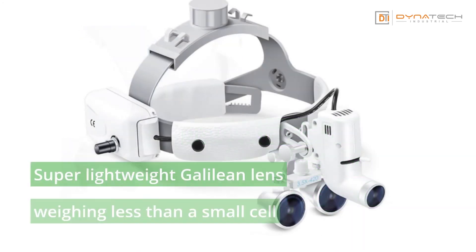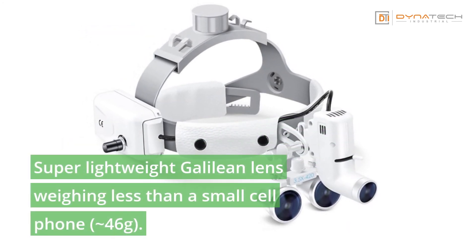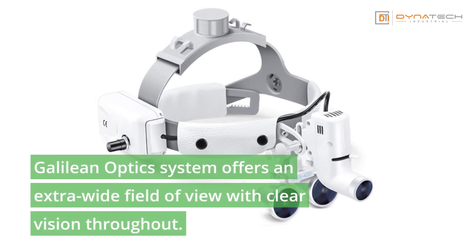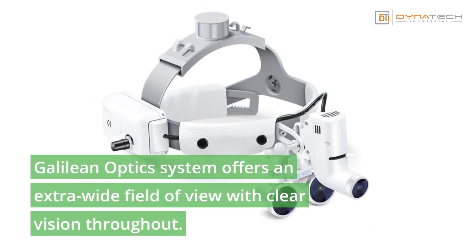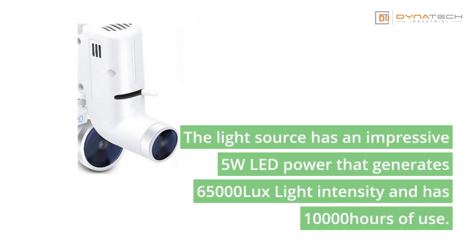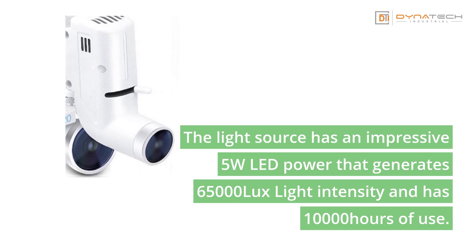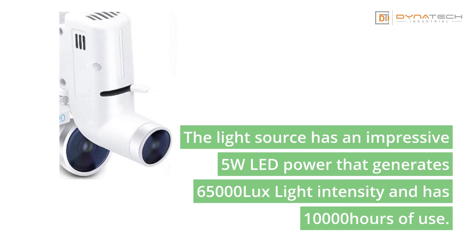Super lightweight Galilean lens weighing less than a small cell phone — only 46 grams. The Galilean optics system offers an extra wide field of view with clear vision throughout. The light source has an impressive 5-watt LED power that generates 65,000 lux light intensity and has 10,000 hours of use.